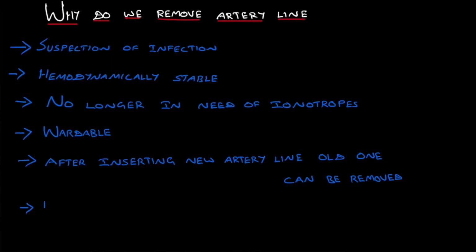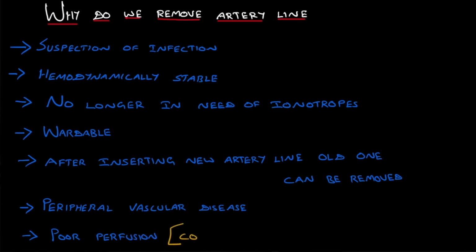That's a good answer, Hermes. Just to add to it, don't forget, if you have any kind of peripheral vascular disease, or if the patient is very cold and there are any perfusion issues, yes, the arterial line would definitely come out.